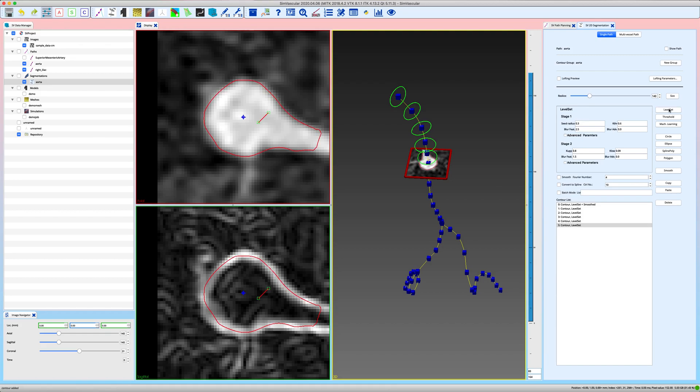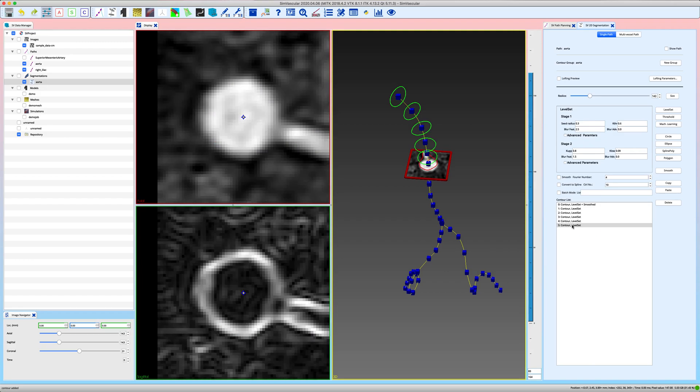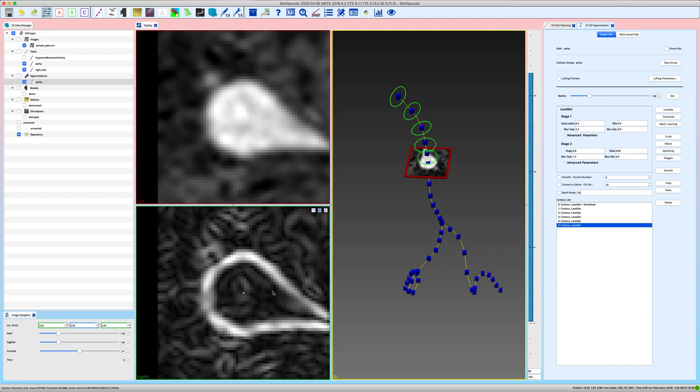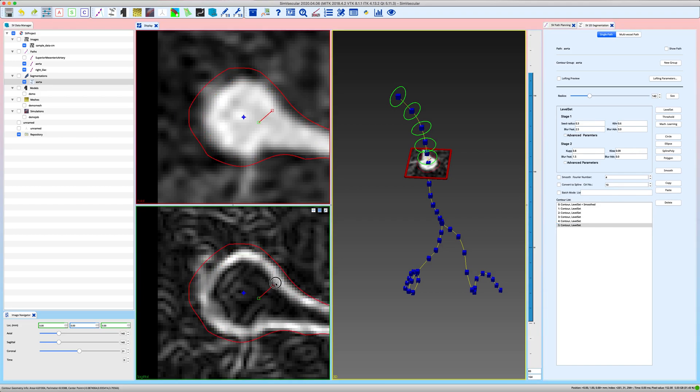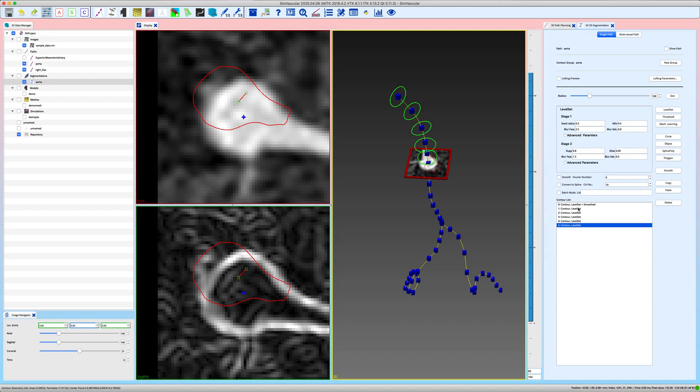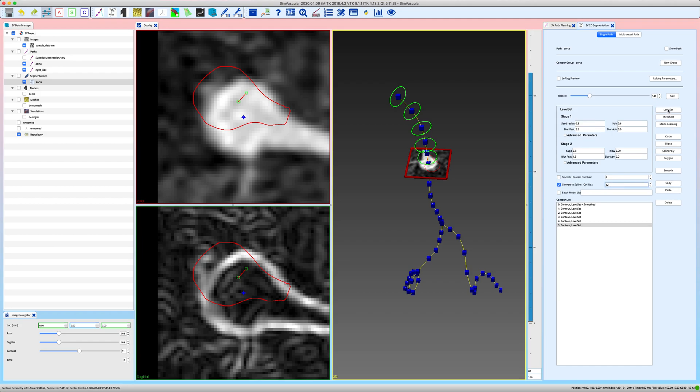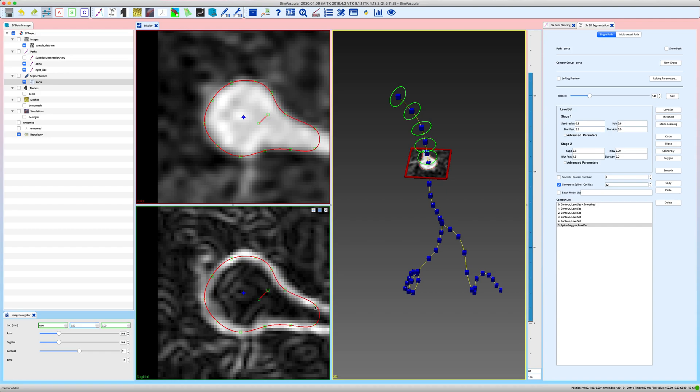Let me jump back to this contour. Okay, if you want to change the shape or location of your contour you have some control points. This control point allows you to change the size of the resulting contour and this control point allows you to change the location of the center point. But of course that's not enough in our case and we have two different options. Number one, we convert the resulting level set to a spline, say with 12 control points. You click on level set again and now you have all these control points on the outline of your segmentation and you can drag them to wherever you want them to be.